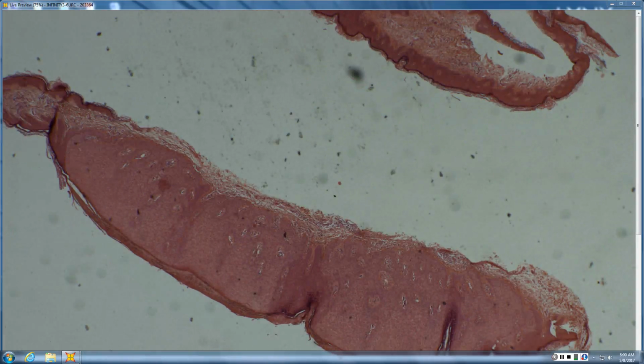Superficial in the epidermis. It's a little faded, but I think it looks a little like poroma. Oh, it's clear cell, sorry. Yes, you are correct. So you said the word, it's a little faded, but only the lesion is faded. One might have said it's a little pale, right? But with a sharp cutoff to where it is not faded or pale. There's always a neutrophilic scale crust and neutrophils and neutrophilic debris if you look on higher power. But it's a scan diagnosis, that sharp cutoff of the pale area to the normal epidermis. So clear cell acanthoma, well done.